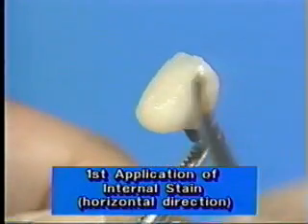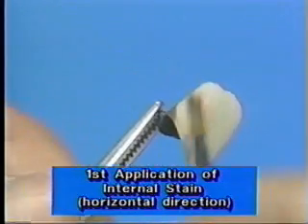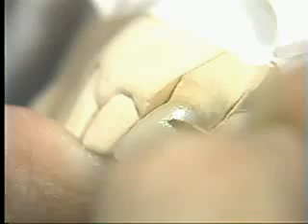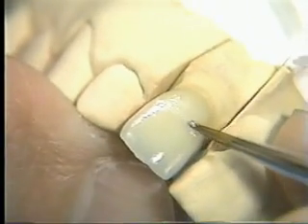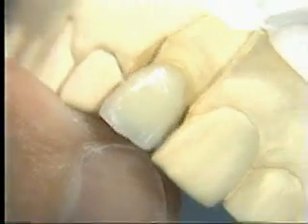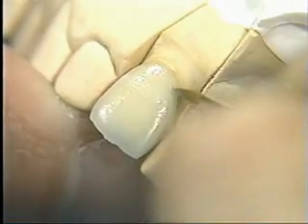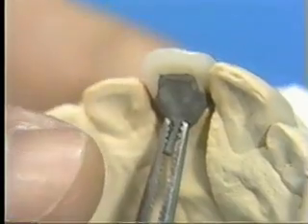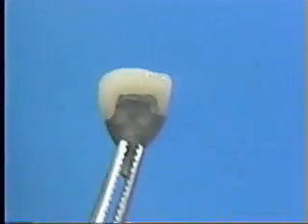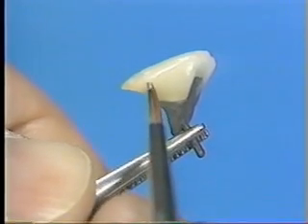Before the first application of internal stain, wet the whole porcelain area with internal stain liquid. Confirm the position of the transverse groove before staining. The white line is made up of a mixture of white and bright at a ratio of 1:1. Remove the metal framework from the die and extend the white line to both the right and left side of the proximal.